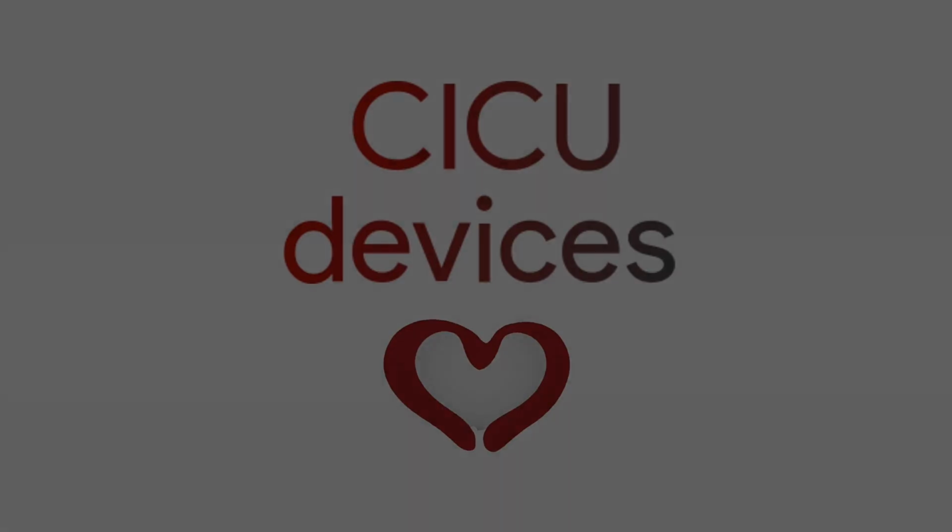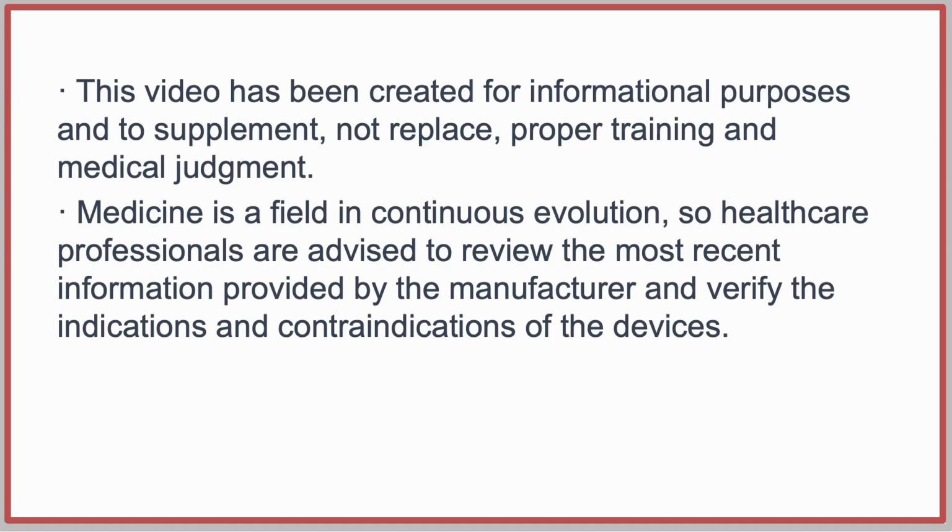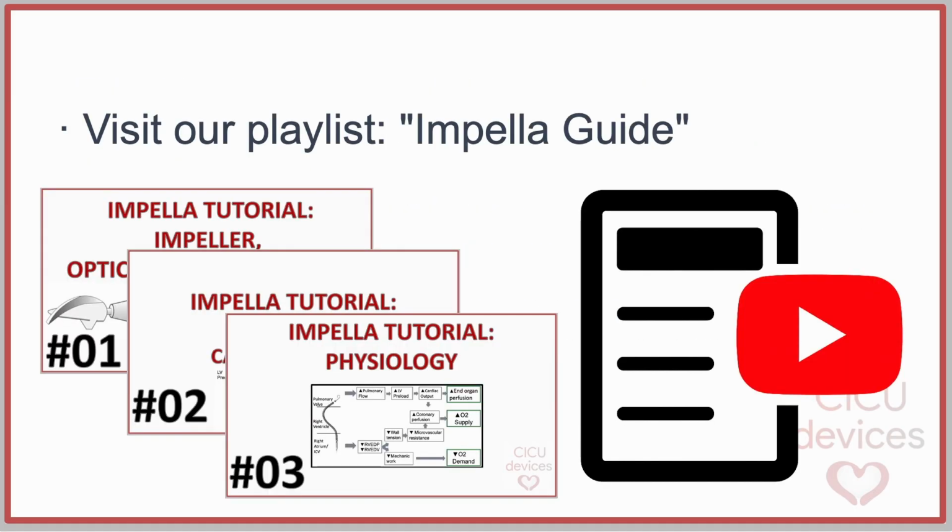CICU devices. Impella CP and Impella 5.5, the console screens. For more insights on Impella device, we invite you to visit our Impella Guide playlist on the CICU Devices channel.